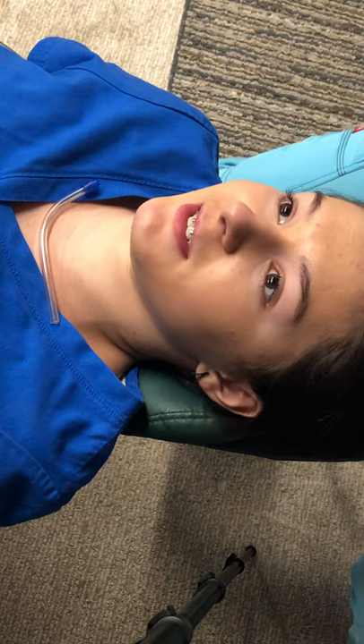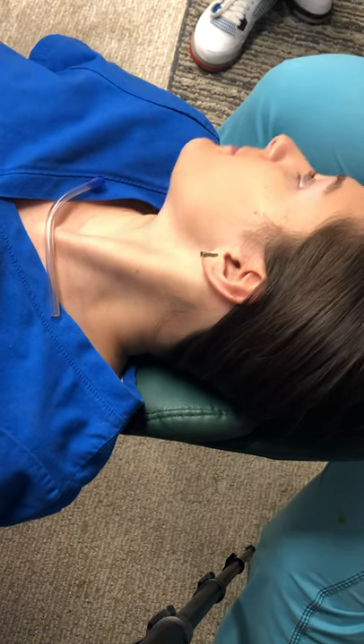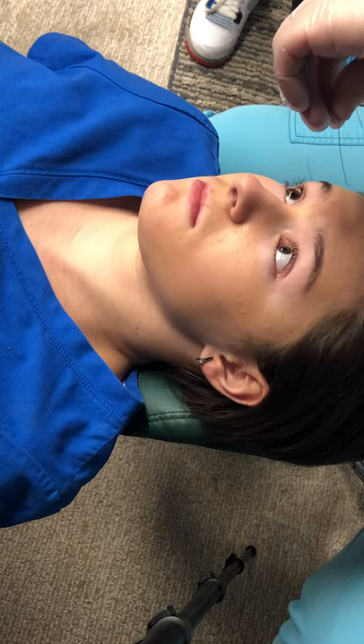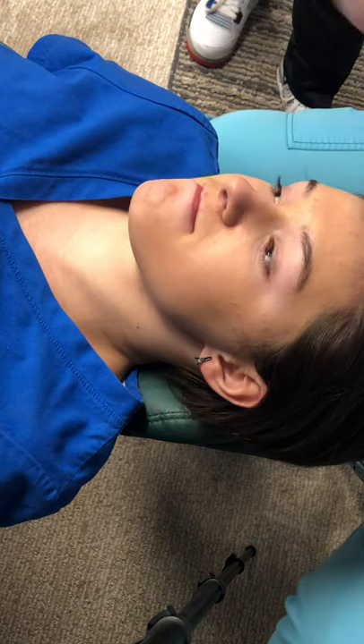Usually you start out with a 14 NiTi — NiTi stands for nickel titanium. This wire is way too long; if I just stick that in there it's going to poke her back there. What I suggest is take her models and size it up to the models and then cut it. This distal end cutter — because anything away from the midline is distal — is going to cut and hold so it doesn't shoot across the room or into her eyes. I always point it at the floor and then put it on the tray.